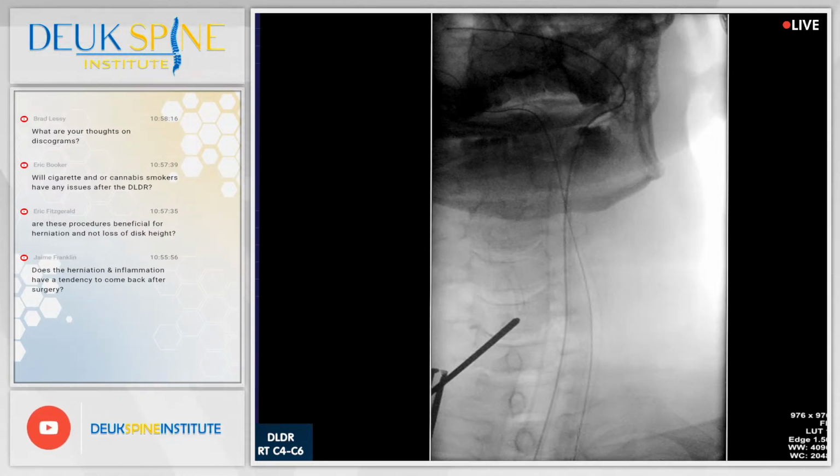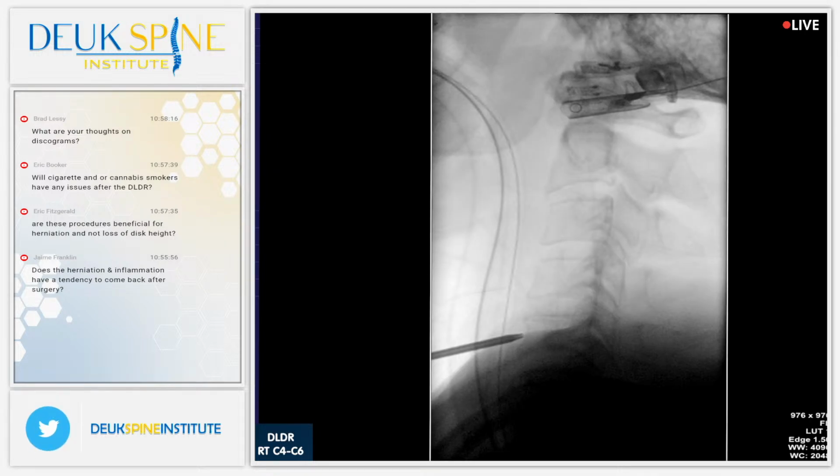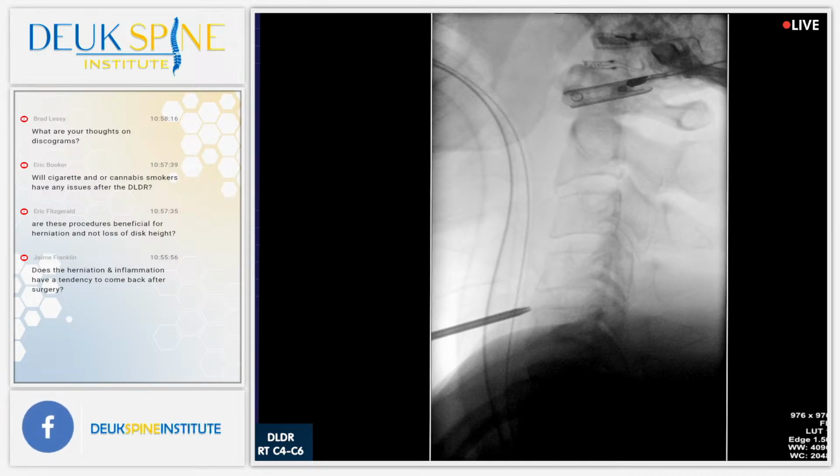Let's go back to a lateral. I'm using the X-ray machine to guide and to localize. We call that localization and navigation. The part of moving things around in the patient is navigation. It's like navigating a boat or a plane.